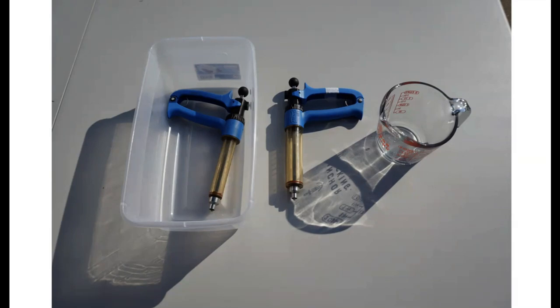And so by putting in that metal needle in there, it breaks the surface tension of the water and forces it to bubble when that temperature gets hot enough, so I don't have to worry about that. I'm not an electrical engineer. I'm not a mechanical engineer. I'm a ruminant nutritionist and a beef cattle specialist. So you have to decide if you're comfortable putting that metal needle in the microwave.